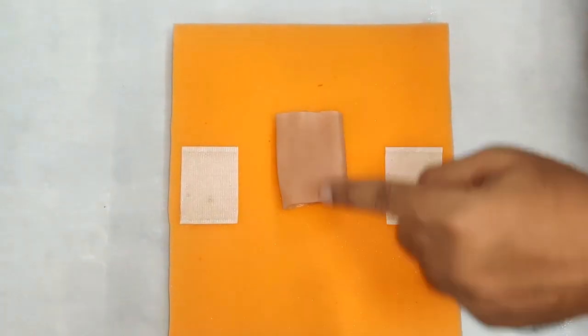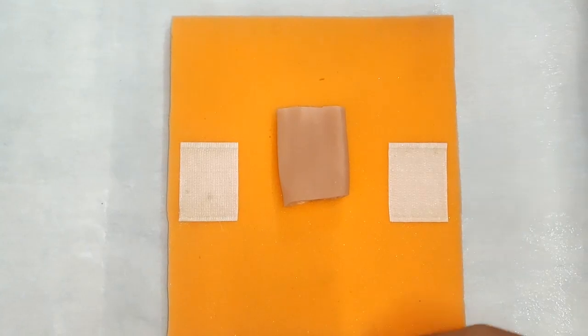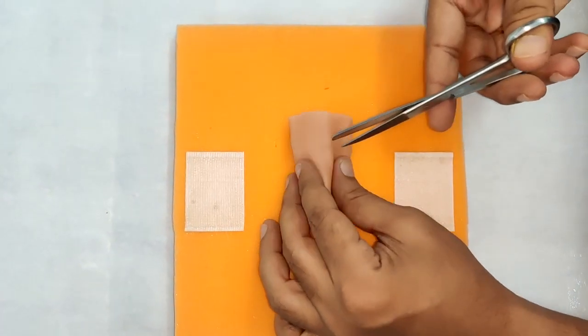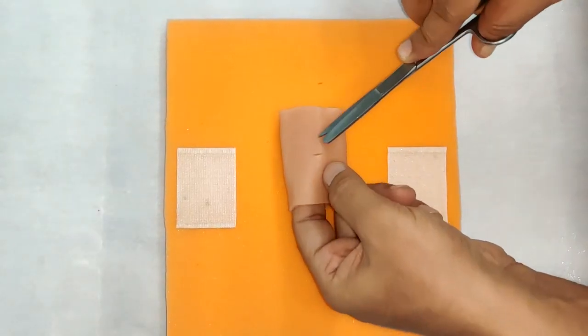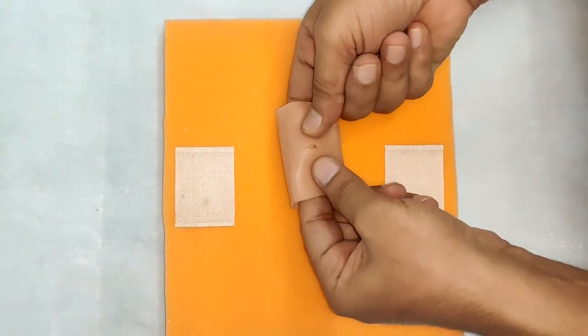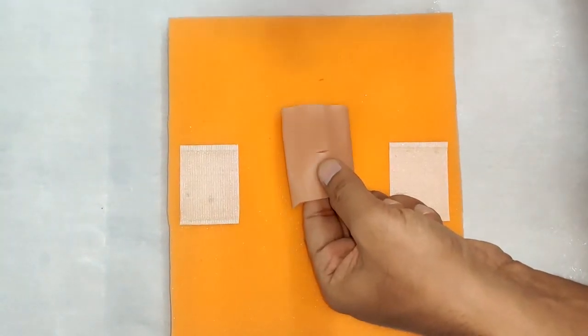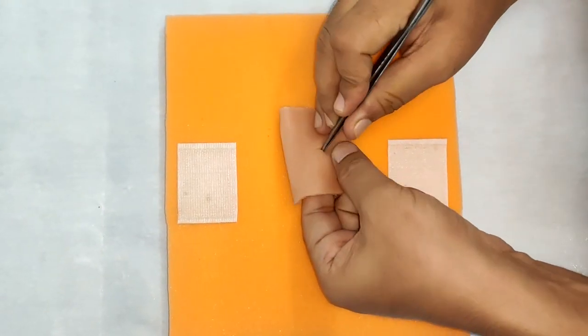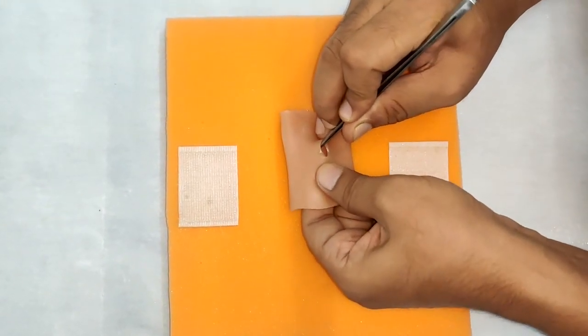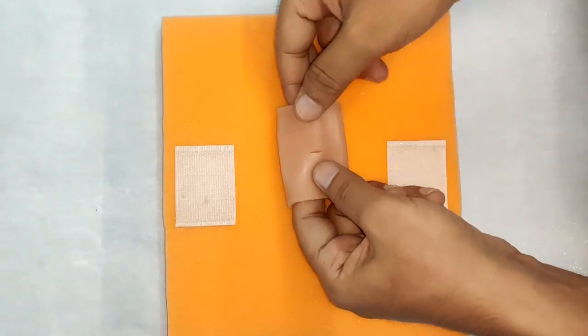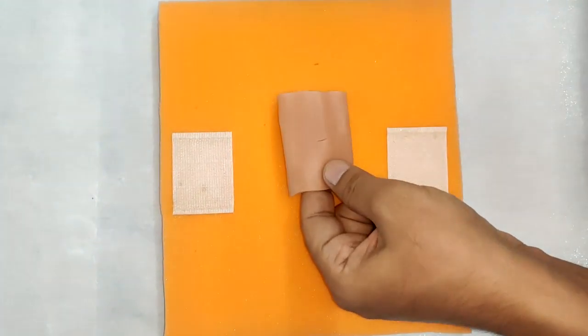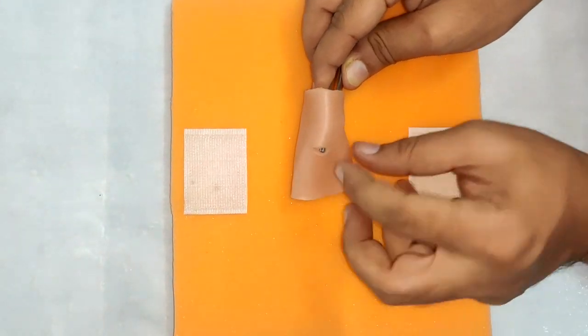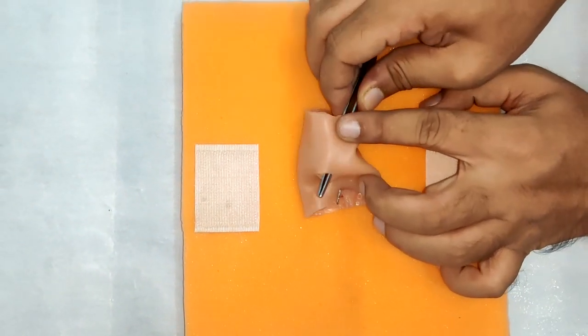Assuming this is the length of the intestine and there is a small perforation or break. Normally, a perforation will be a round hole with mucosa popping out from inside. We can see there is a hole in the intestine.